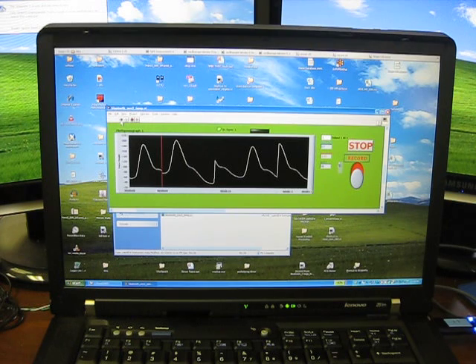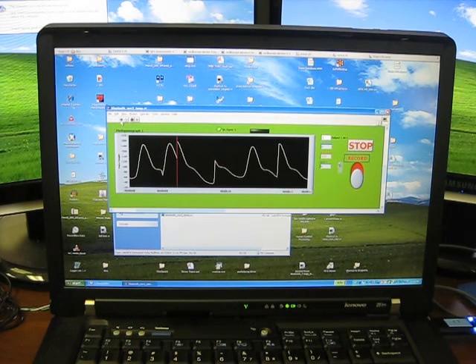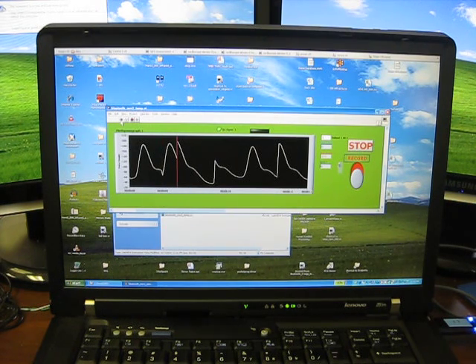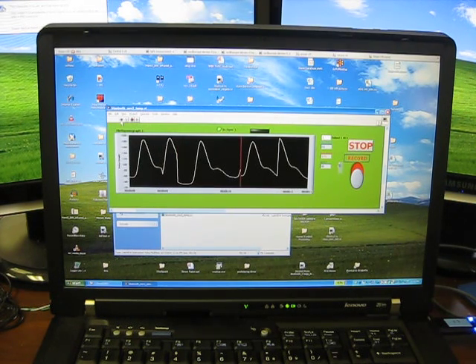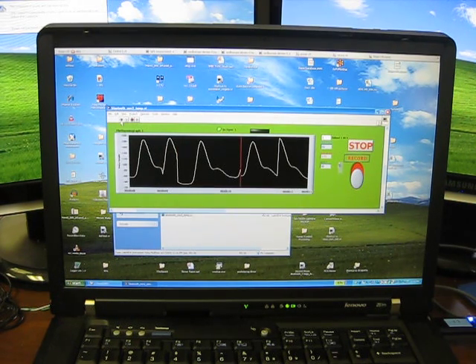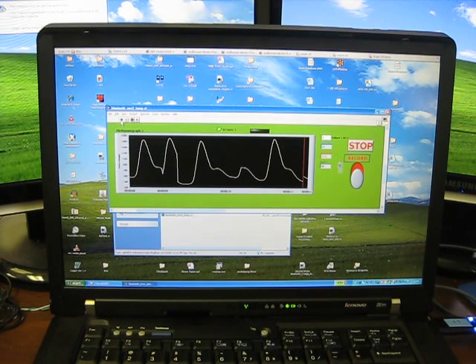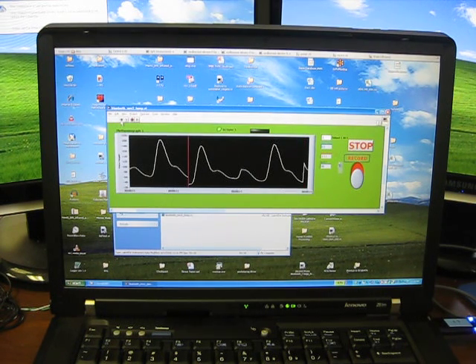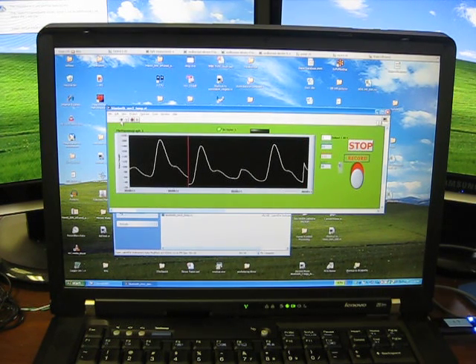That's the pulse oximeter signal, or also called PPG or photoplethysmograph signal, on the computer screen.